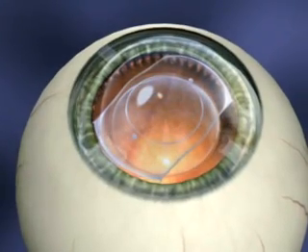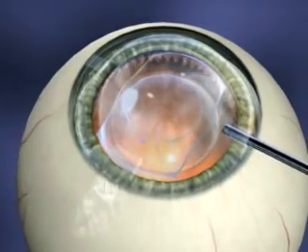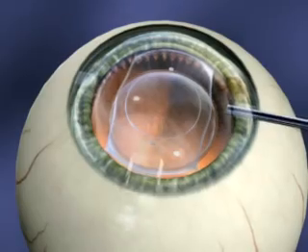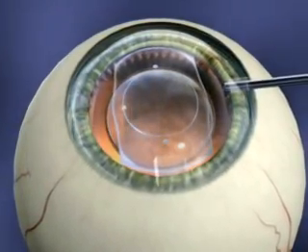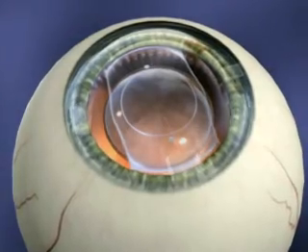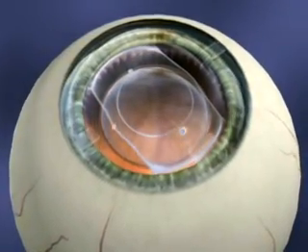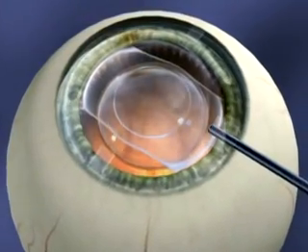Thoroughly remove the viscoelastic by irrigating the anterior chamber with BSS through a 27-gauge cannula with slight incisional pressure. Thorough removal is a critical step to avoid early post-op intraocular pressure spikes. After confirming that the footplates are behind the iris and that all the viscoelastic has been removed, constrict the pupil with Myocol.